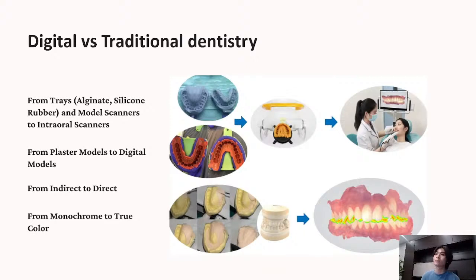From left to right, the way has changed from the traditional tray, using alginate or silicone rubber and model scanners, to intraoral scanners, and from plaster models to digital models. We can say the way has changed from indirect to direct, from monochrome to true color.